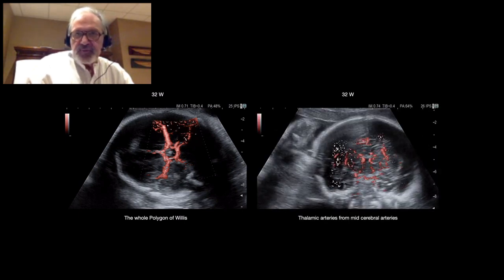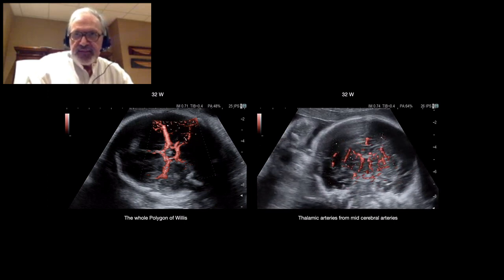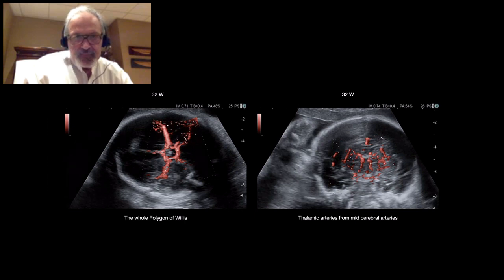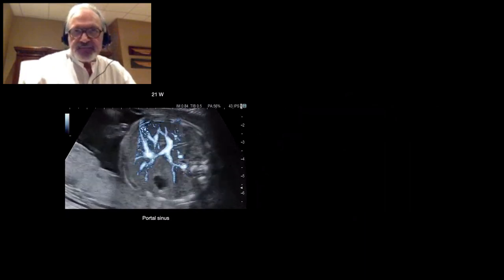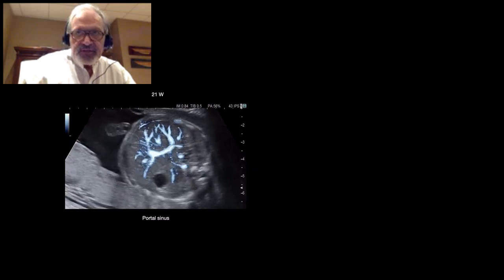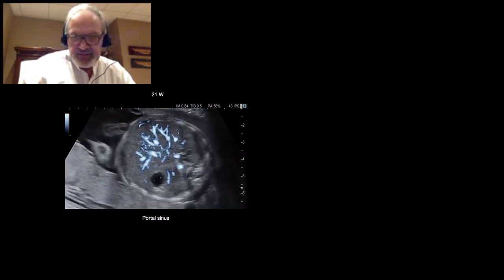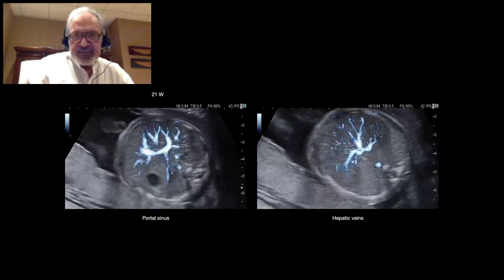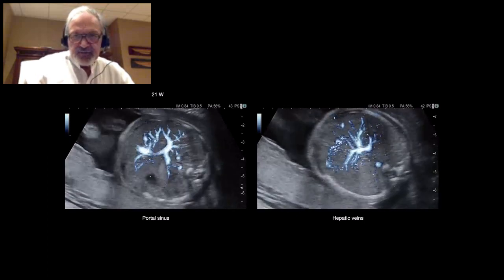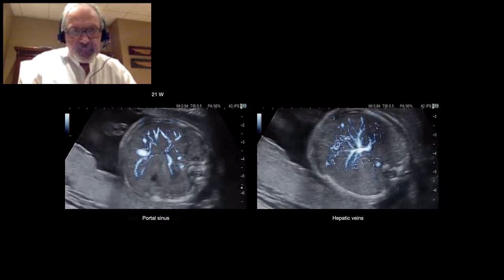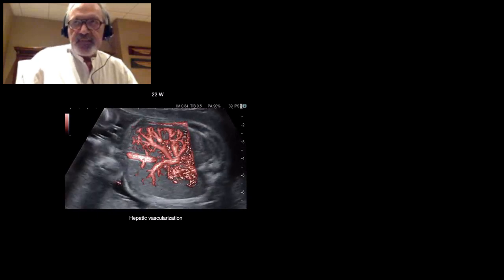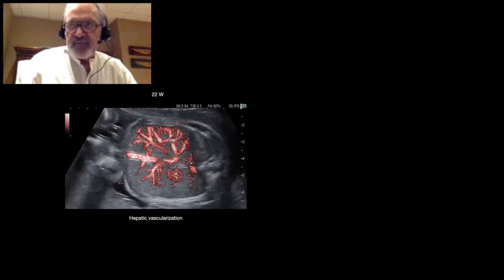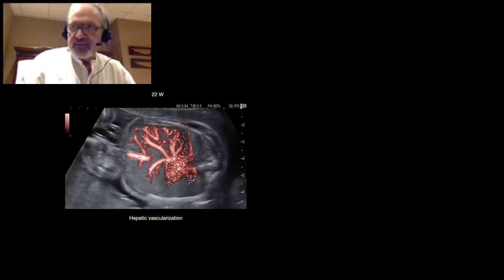In frontal view, we can see the tiny thalamic arteries coming from the mid-cerebral arteries, as you can see here. In abdominal view, we have the portal sinus. The hepatic blood circulation is richly represented with DFI. Here, we have hepatic veins coming to the inferior vena cava. Here, we have umbilical veins, portal vessels, and hepatic veins — these vessels are all visible at the same time on this section.